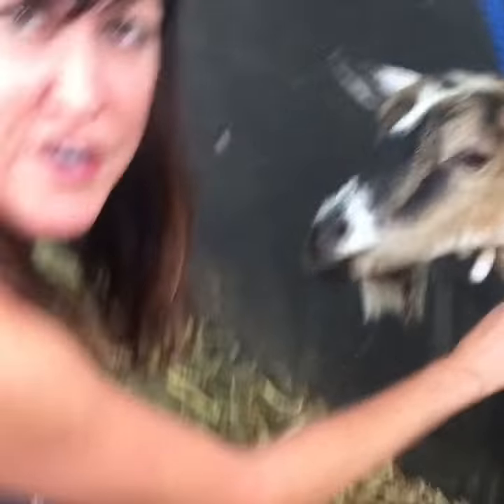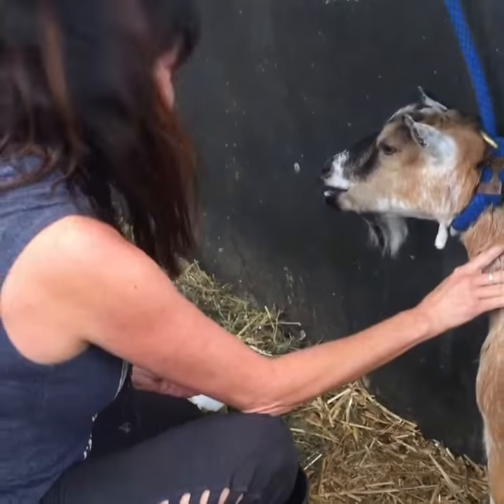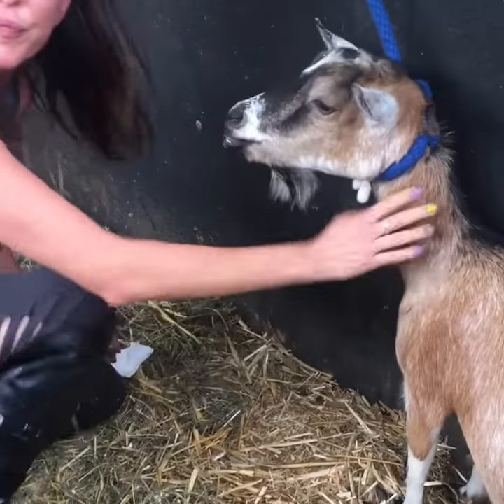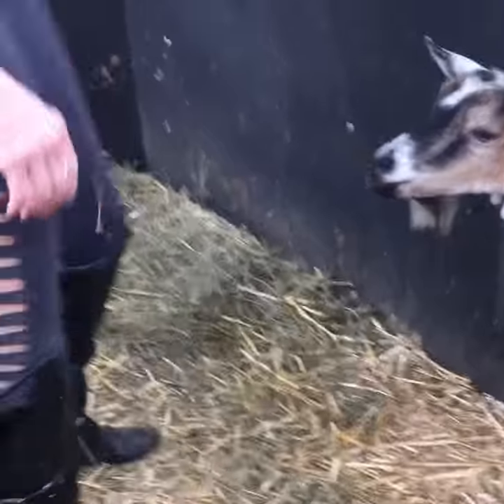This is a good little goat. What's her name? Kara! Oh yes, you did so good. That was a good IV injection. She's going to be very hydrated. That was lactated Ringer's solution. She's ready to go to the party. Yeah! Good girl!